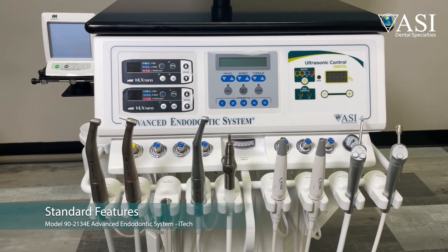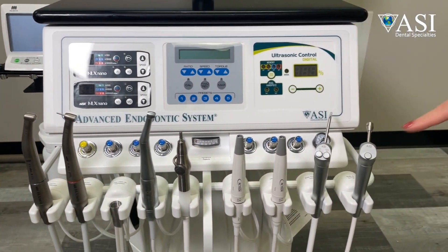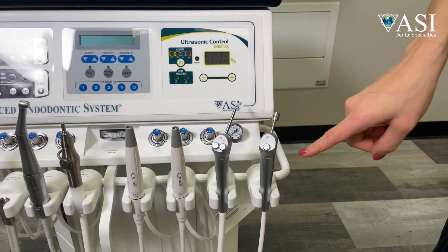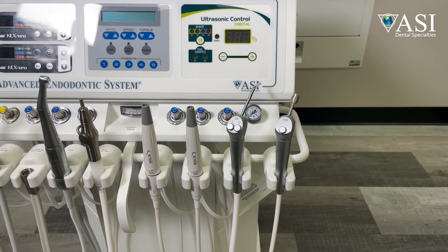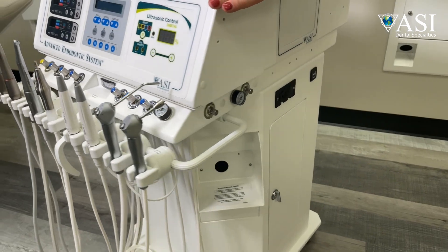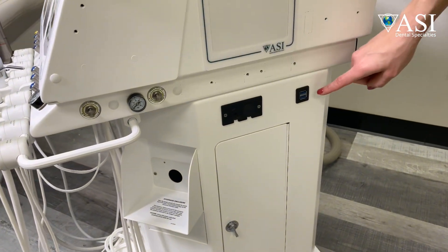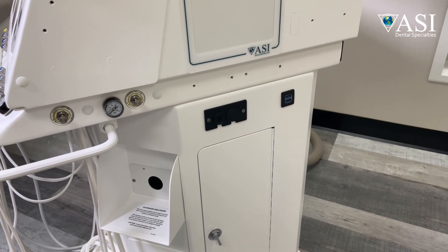Standard features include air handpiece connections for your high speed and low speed, air water syringe, and Stropco Endo air only — which has a single button with air pressure adjustment so you know exactly what's coming out of your Stropco tip. There is also a USB external port on the left and right side of the cart for plugging in USB devices such as digital sensors.